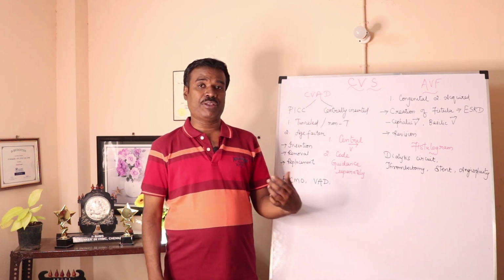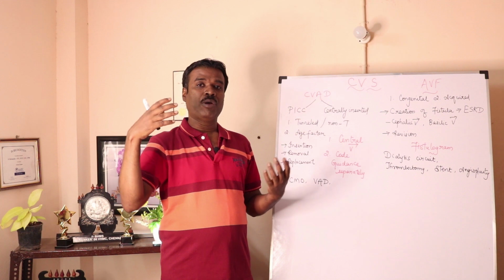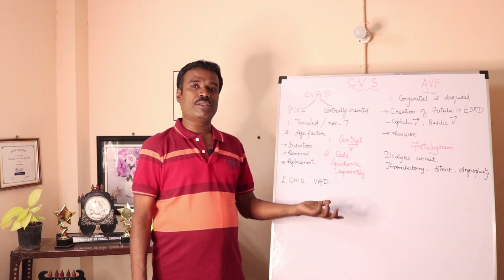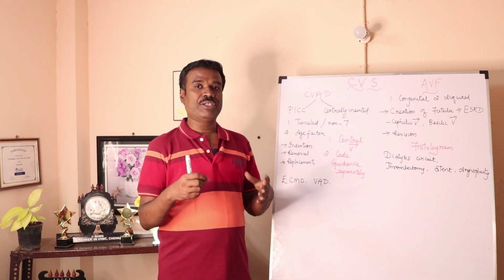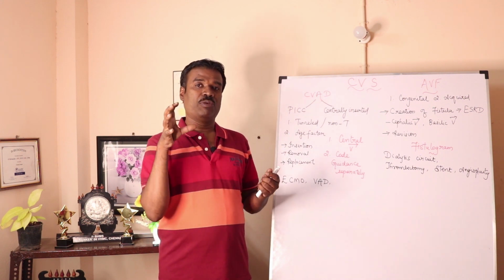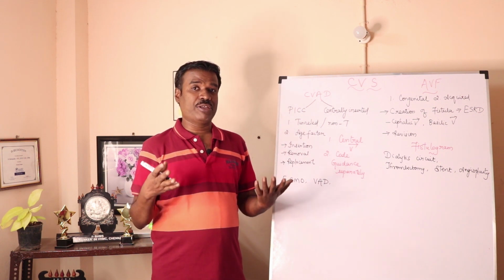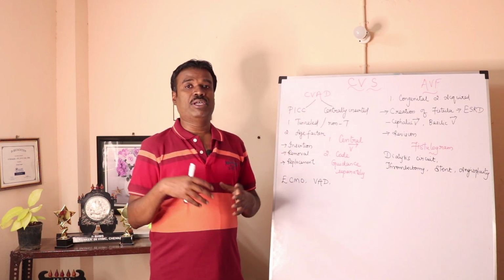Next come devices, assist devices. Say a patient who is going to be subject to a CABG tomorrow or a valve replacement procedure the next day. Today, they might be doing this CVAD procedure, plus they might be doing some assisting device procedures like a VAD, ventricular assist device, or an aortic pump. These devices are placed prior to the operation, which gives energy to the ventricle to pump or act more efficiently. Or when there is a ventricular failure, they might resort to such procedures in order to make the surgery a successful one.